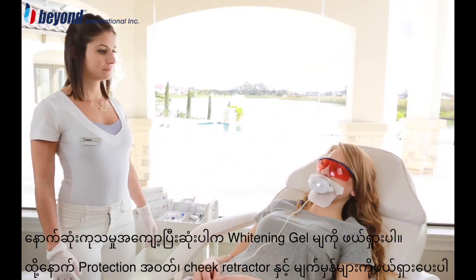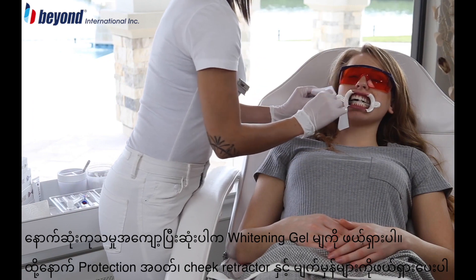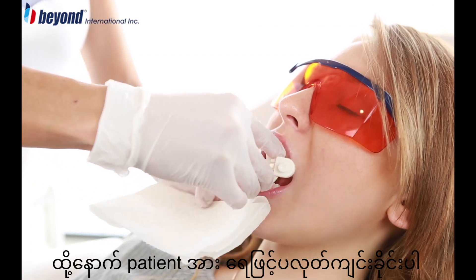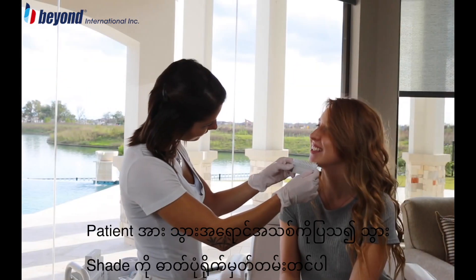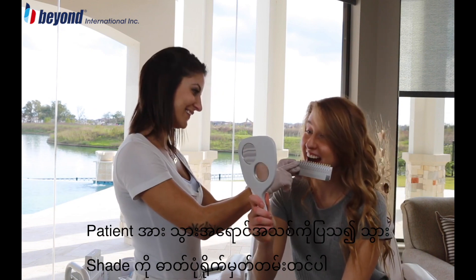After the final cycle, wipe off the whitening gel and remove the face protection cloth, cheek retractor, and protective eye goggles. Then ask the client to rinse their mouth with water. Show the client their new teeth color and take a photo to document the shade after the treatment.